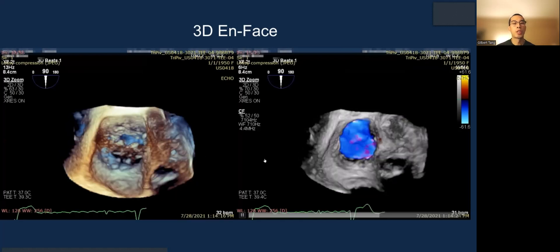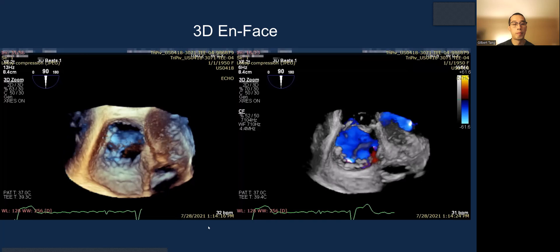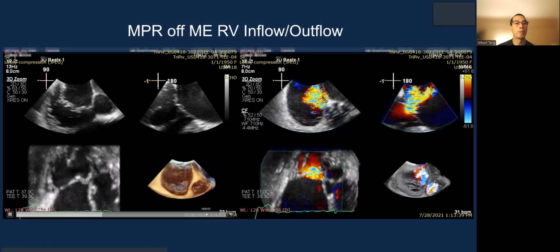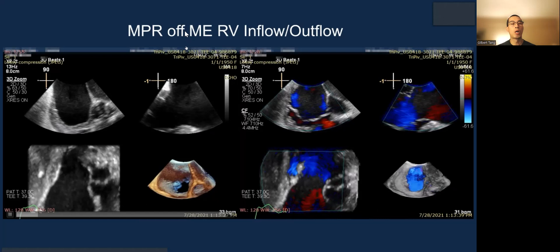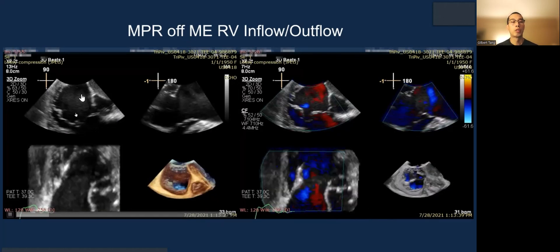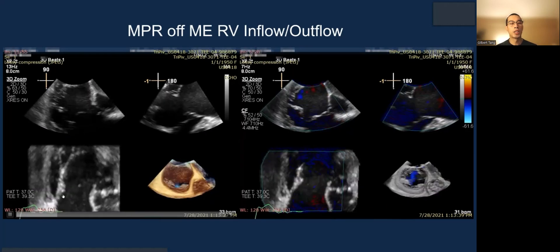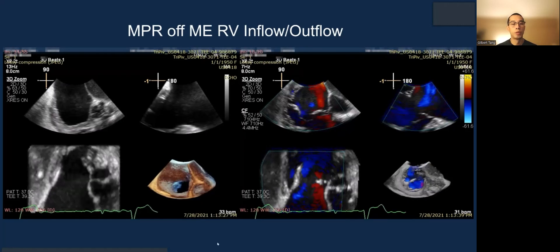3D en-face, as mentioned, can be important and useful if you can get the image quality. And the MPR — this time of the mid-esophageal inflow X-plane — shows very nice images of the inflow X-plane, so you can actually use this view to grasp, with the en-face view as orientation.